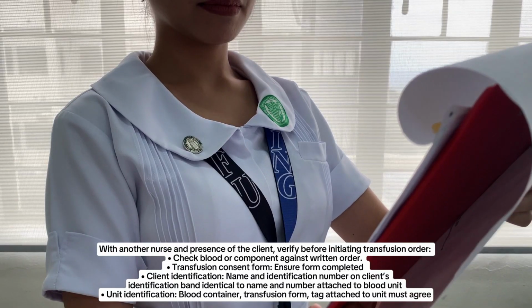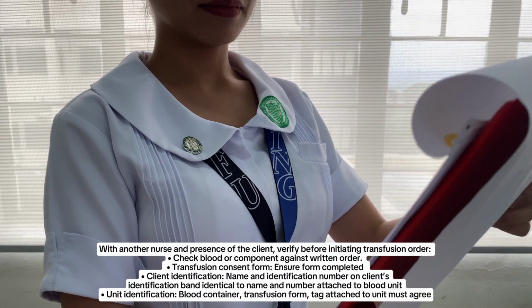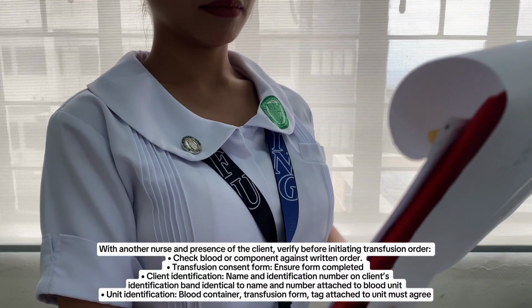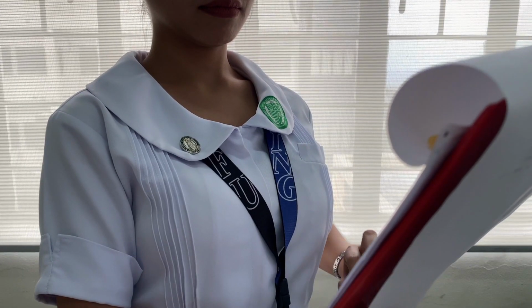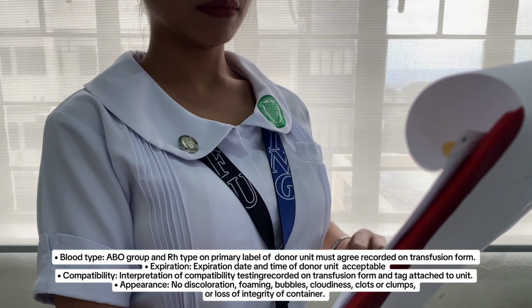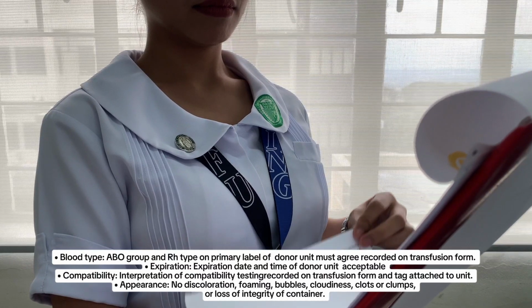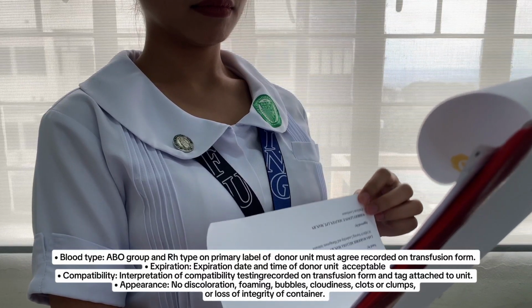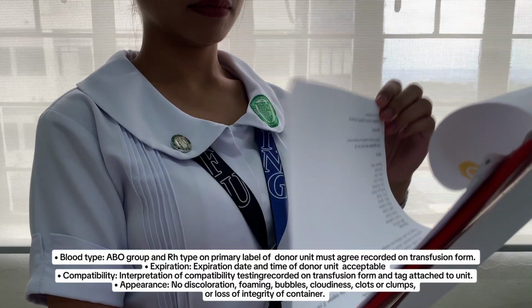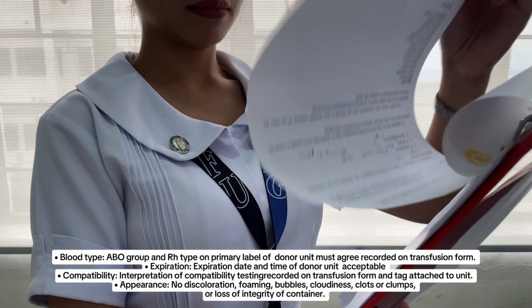Check unit identification: the blood container, transfusion form, and tag attached to the unit must agree and match each other. Blood type, ABO group and RH type on the primary label of the donor unit must agree with those recorded on the transfusion form. Check the expiration date and time of the donor unit and if it is acceptable. Ensure that the interpretation of compatibility testing was recorded on the transfusion form and tag attached to the unit.